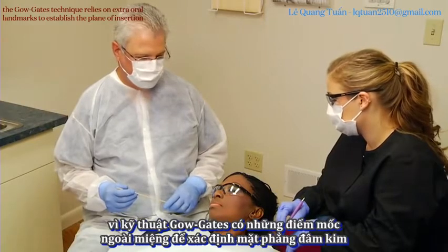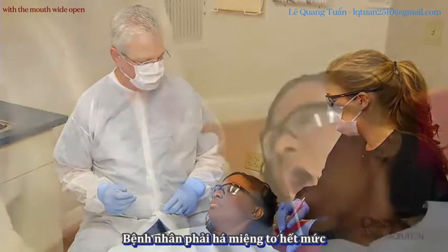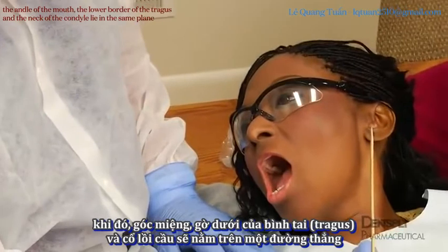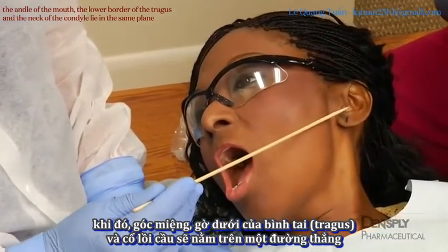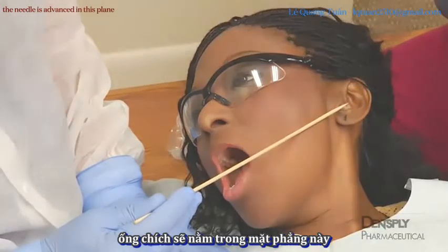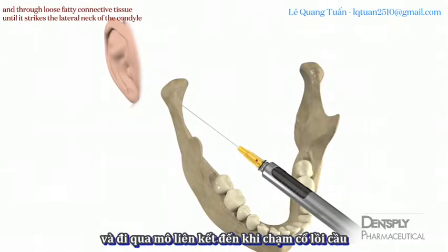The Gowgates technique relies on extraoral landmarks to establish the plane of insertion. With the mouth wide open, the angles of the mouth, the lower border of the tragus, and the neck of the condyle lie in the same plane. The needle is advanced in this plane just medial to the deep tendon of the temporalis muscle and through loose fatty connective tissue until it strikes the lateral neck of the condyle.